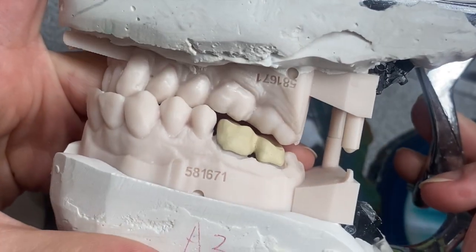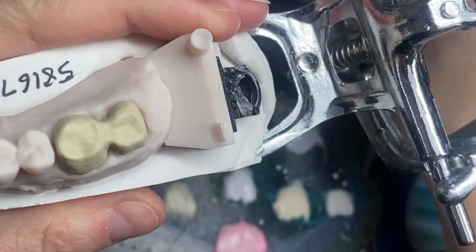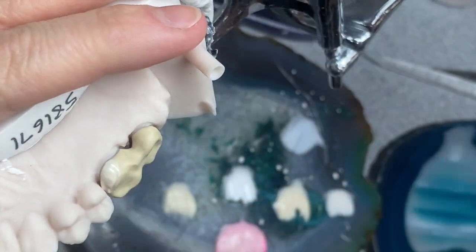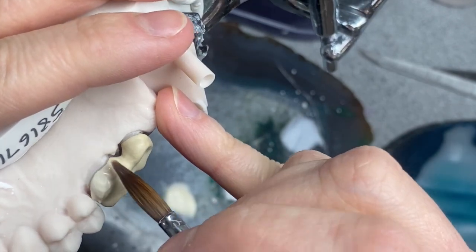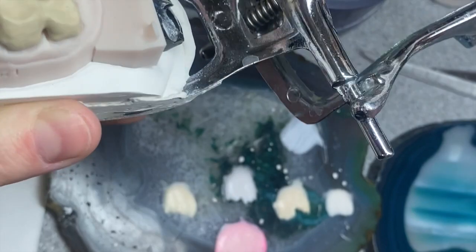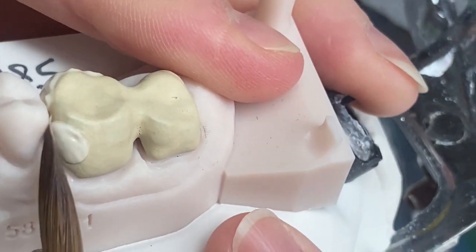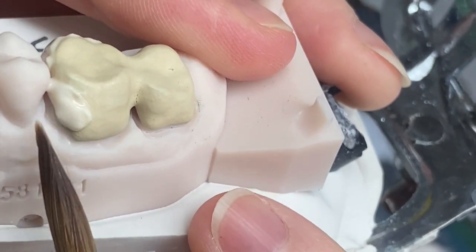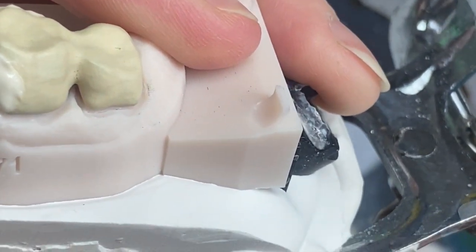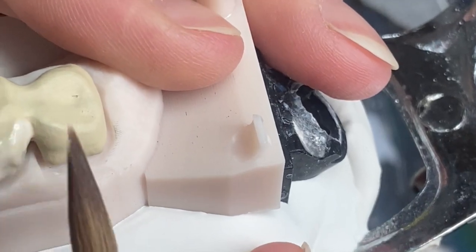Hi guys, in today's video we're going to build this beautiful splint, and I'm also going to be talking about topics you wrote to me in your comments. You were asking a lot of questions, so one of the questions was: what to do if you're using water and not the modeling liquid for buildup, and how to keep your buildup moisture content at the correct level so it doesn't dry out on the model, and how to avoid cracks, pores, and bubbles that come out on your work after you bake it.